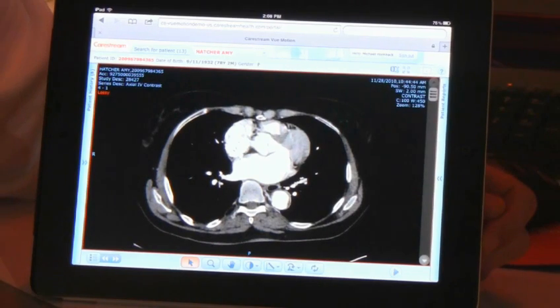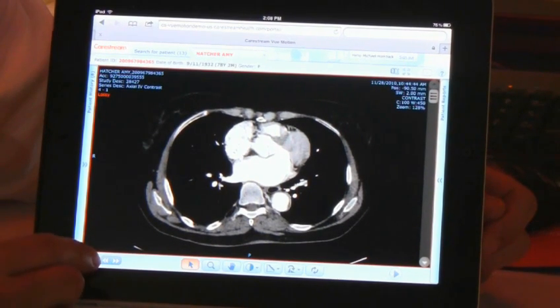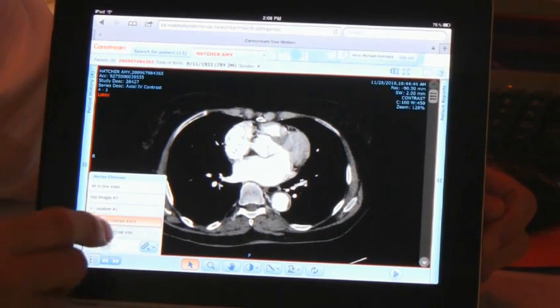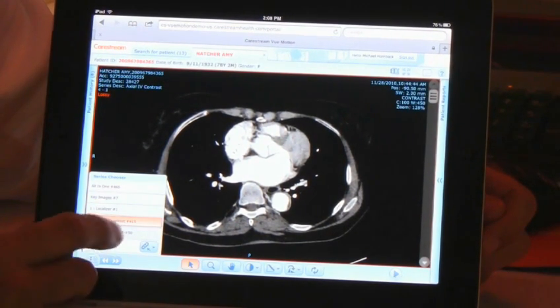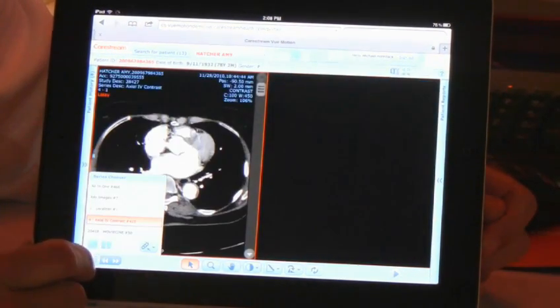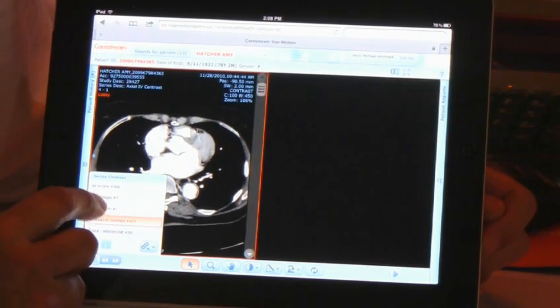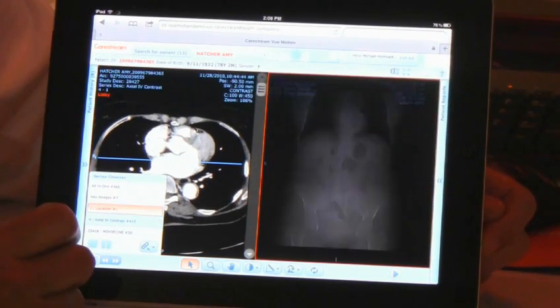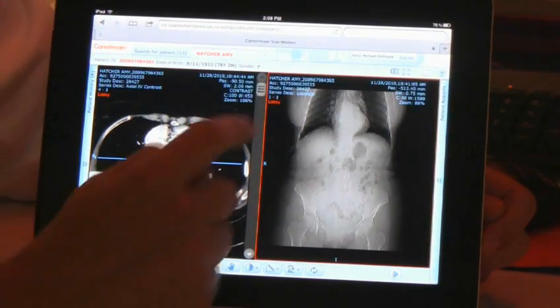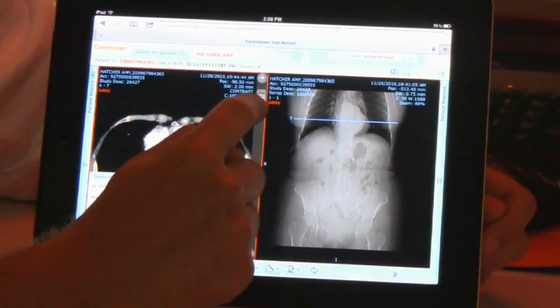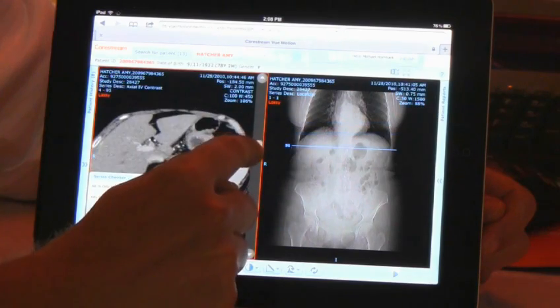What's new in our latest version release is that we're now able to display a split screen, so you can choose to show your initial study along with the localizer and scout marks.